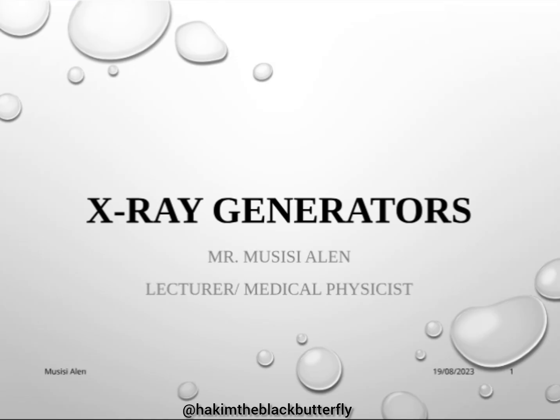Including the kV and mA, you are actually commanding the X-ray generator to modify the electricity such that the X-ray tube can produce X-rays according to the factors that you have fed into the machine.